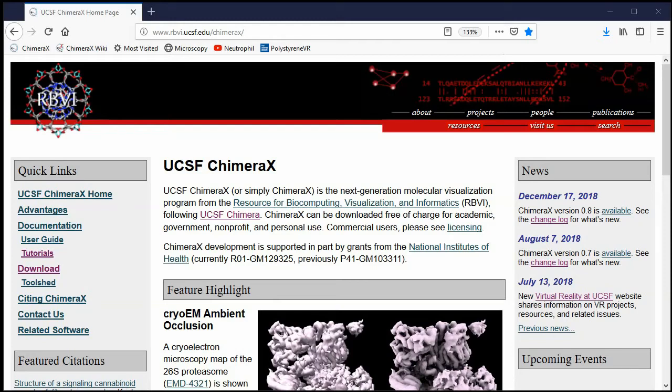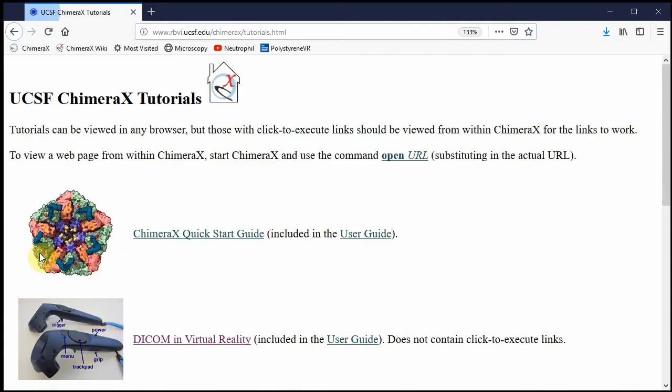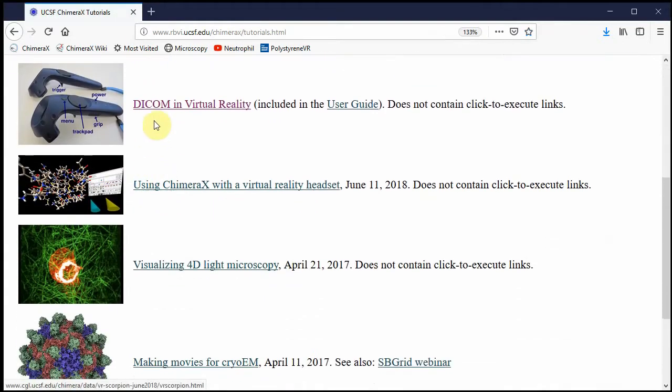I'm going to run through the ChimeraX medical imaging tutorial in virtual reality. I've gone to the ChimeraX website, just search for ChimeraX. On the left there's this tutorials link, and this DICOM in virtual reality tutorial is the one we're going through.